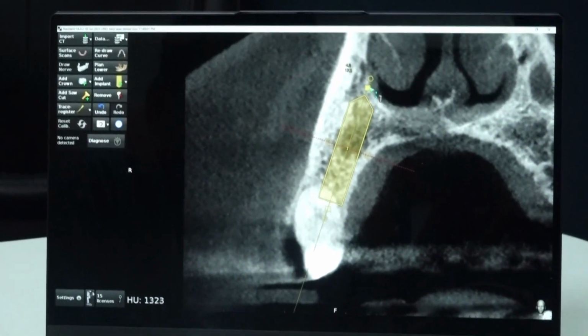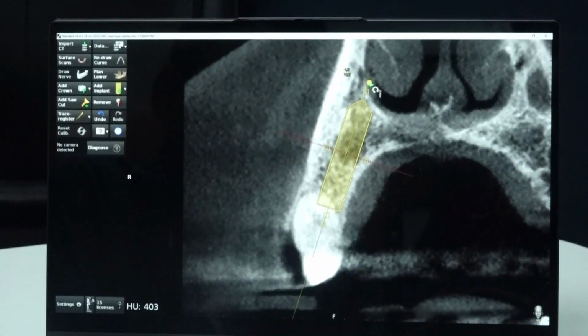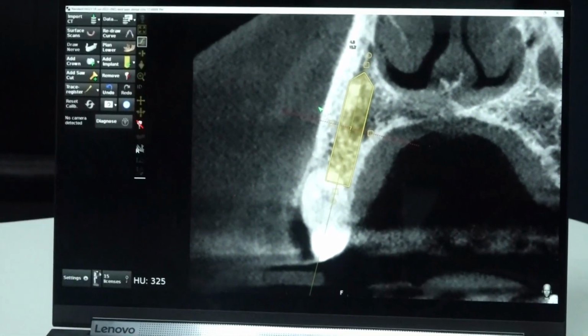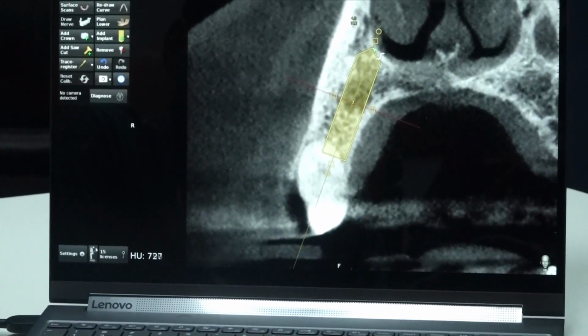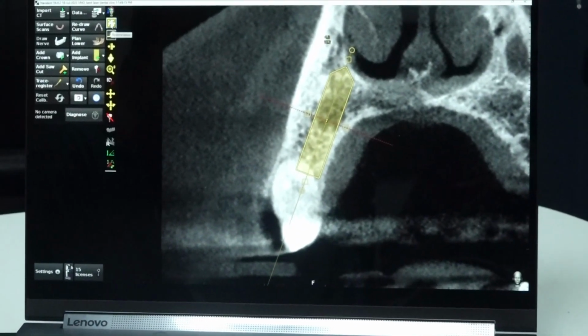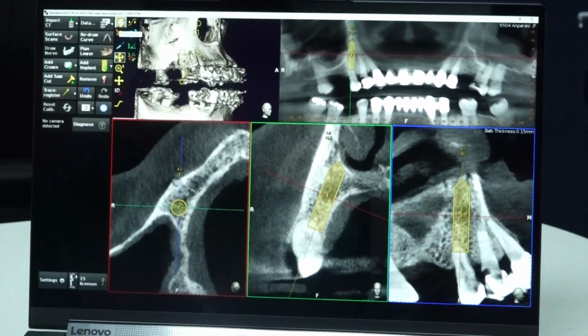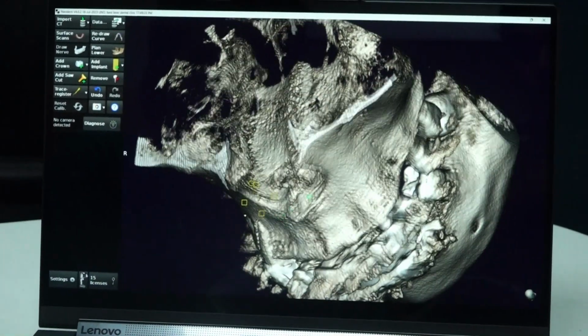Almost you can get 17 mm, 18 mm in place. Even you can place it little closer to the buccal wall or along the palatal vault. So just a 10 degree tilt puts you into the good bone.